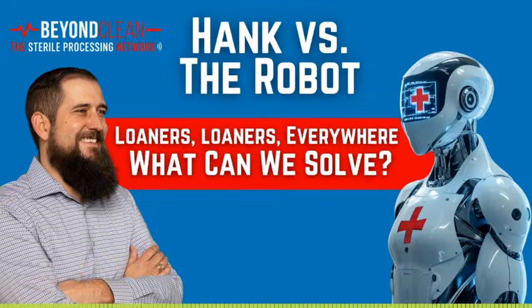Are there supposed to be any cracks in the container or the lid themselves? What is the status or the quality standard of the instrumentation itself? And how do we know in sterile processing? And what's the protocol if we feel like something is not meeting a quality standard and we're already under this tight time constraint with the tray itself?